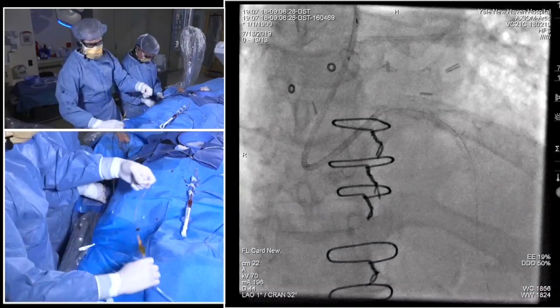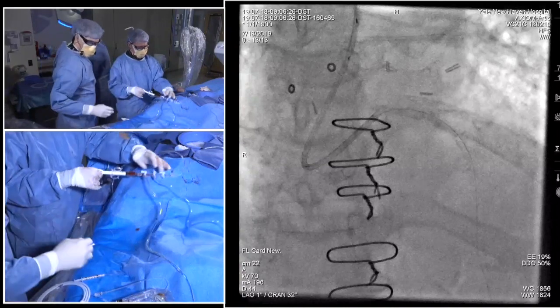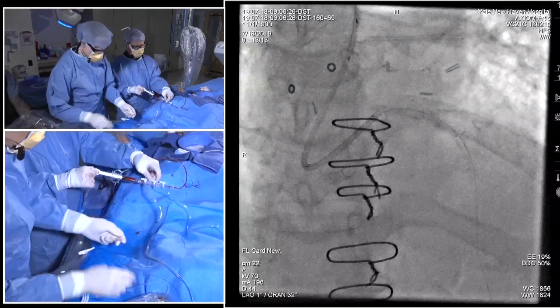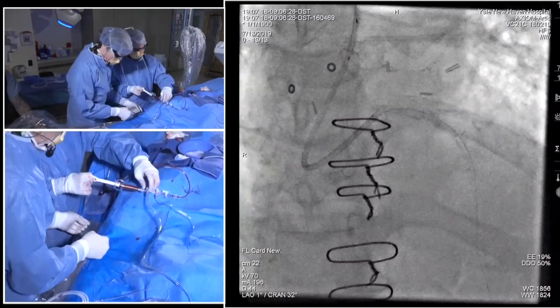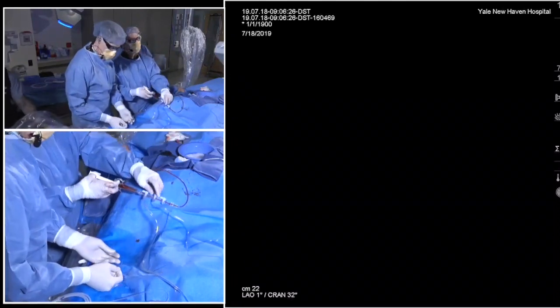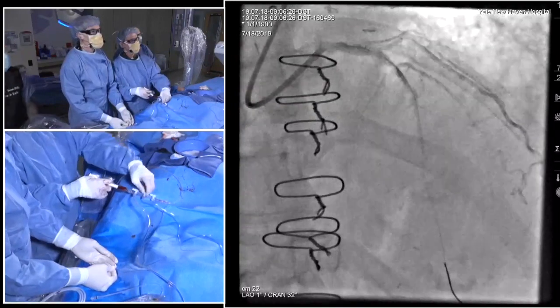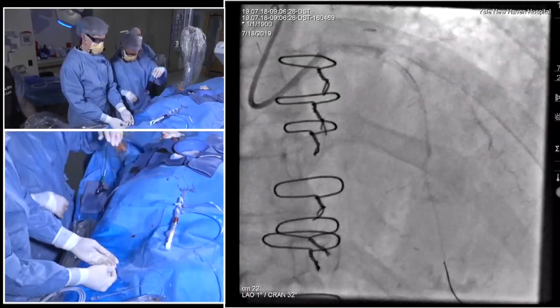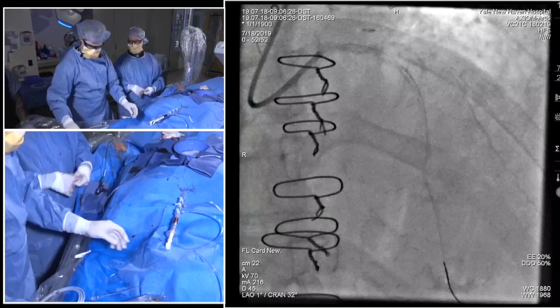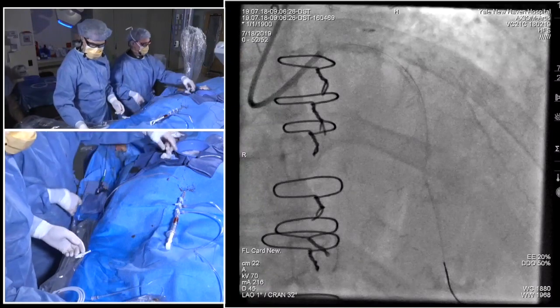Yeah, I mean, 100%. It's a telltale sign, and many of us have taught this during fellowship. If the patient starts coughing, they're about to go into pulmonary edema and they're going to get sick. Well, if the wedge starts rising or the PA pressure starts rising, that happens before they start coughing. So for low EF patients or patients with borderline EFs, we'll often have a right heart cath in and keep it in during the case, monitoring it continuously. For normal EF, if the EDP was fine at the beginning, I probably wouldn't. But that's a great point for when you want to think about it.